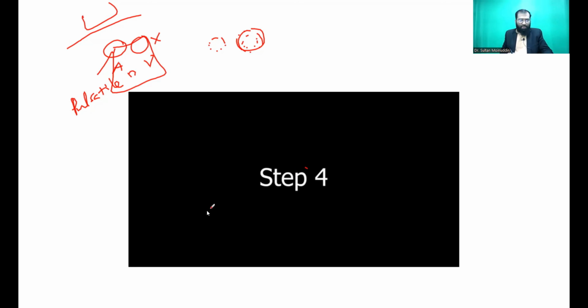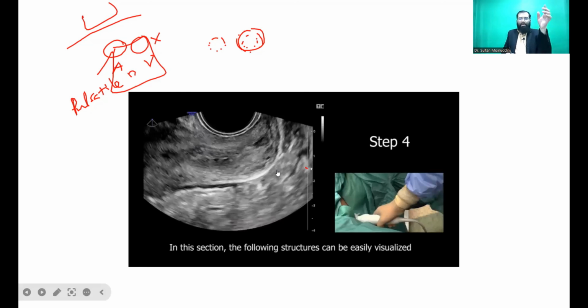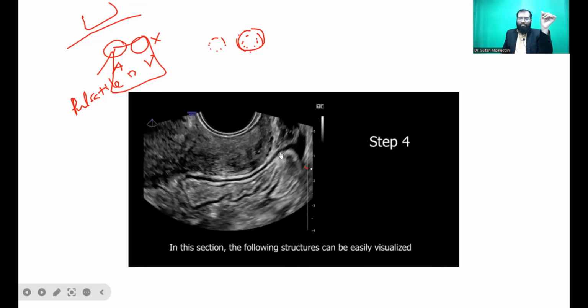Now we come back to the video. So now we are able to see that in the lower end, after TVS examination. I'll go back, so we have done TVS. This is the view which we get. As soon as you get this, see, we are adjusting the depth. We look at the cervix. Whatever part is to be examined has to be focused well on the screen. And now we are panning. So look how we pan across the structure.